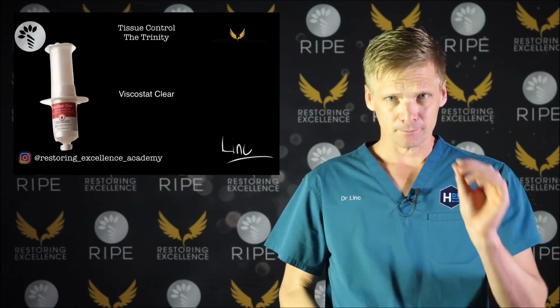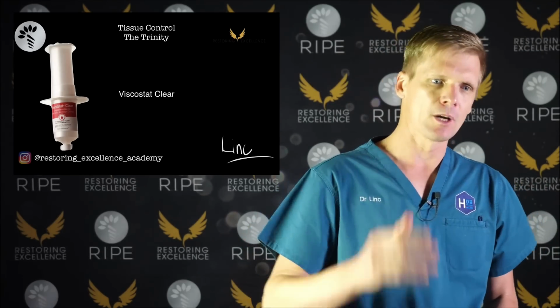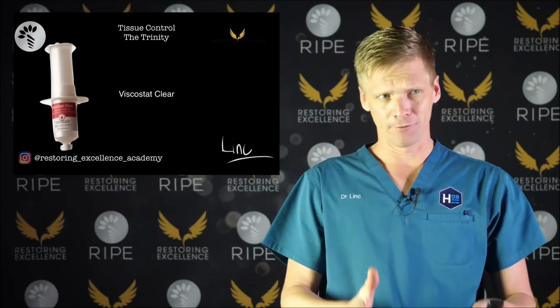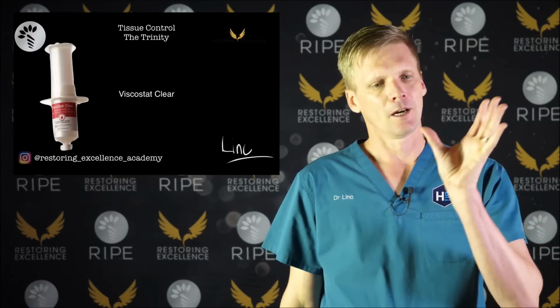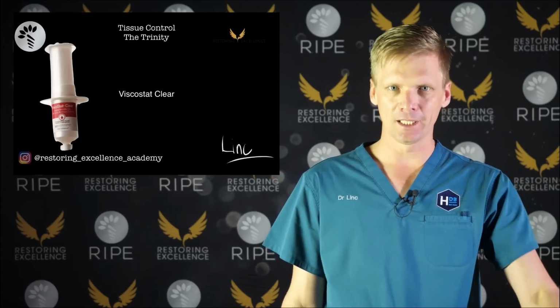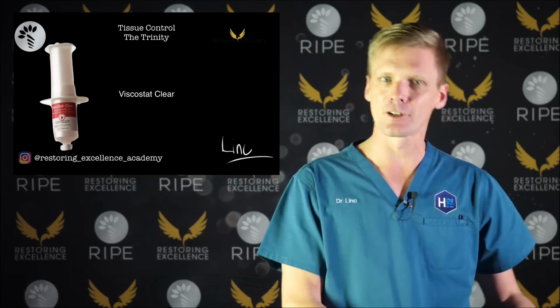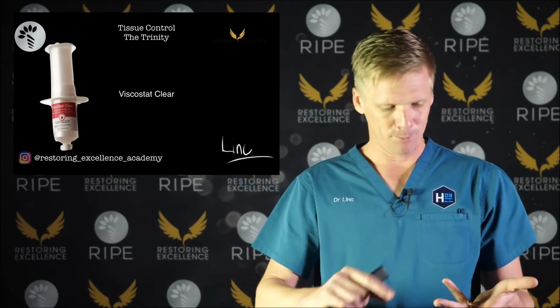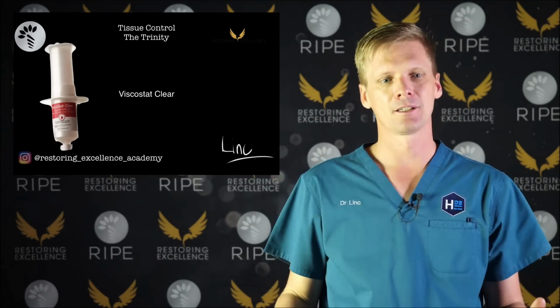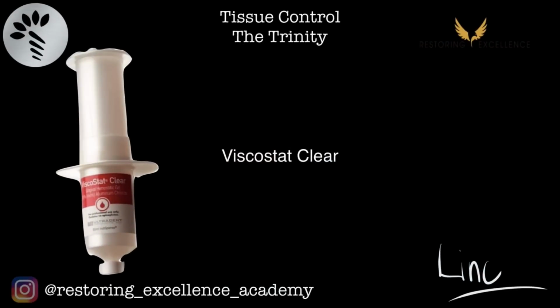Viscostat Clear. There's lots of astringent type medications and so on. I've used Viscostat Clear for 11, 12 years now. It's aluminium chloride. It doesn't stain things. So if you use anything with iron, it can stain. Iron is fine if it's for cementing. So if you're doing a cemented crown, a PFM, porcelain fused to zirconia, that is fine. But a lot of times we're bonding or we're using zirconia, and we don't want to have black or brown margins. So I always use Viscostat Clear.